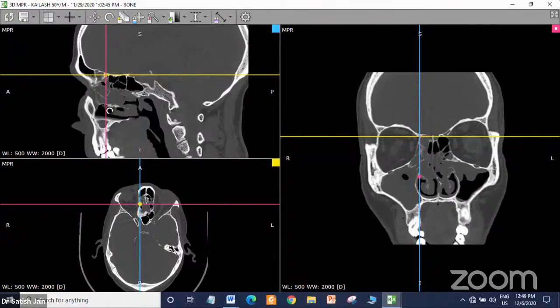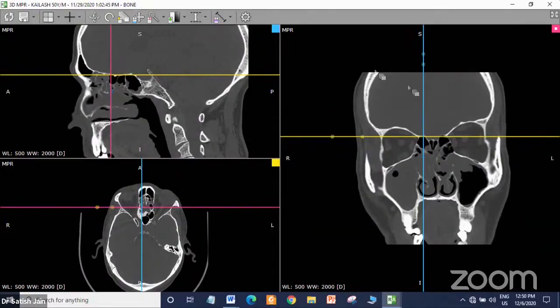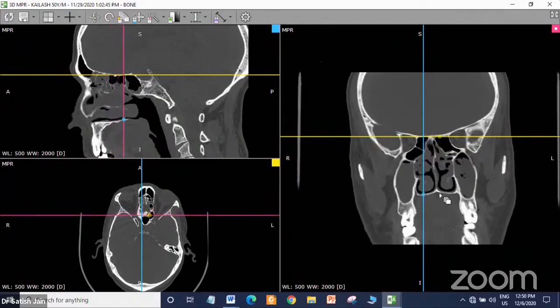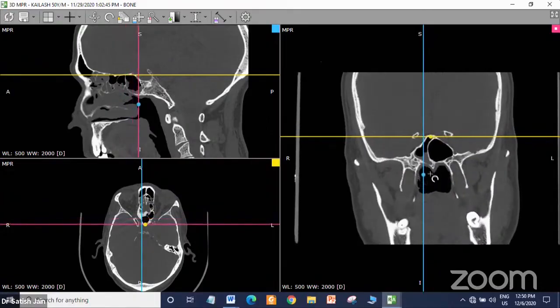So you can say the anterior ethmoidal artery runs through the posterior-most part of the anterior ethmoidal roof. And that is the landmark for the beginning of the posterior ethmoidal roof. That is how you can take this artery as a very good landmark on CT scan. So these are fine points. Reading a CT scan requires time. I am just going through quickly to run through some important points, and you can see the opacification everywhere. Some deviation of the nasal septum, extreme deviation.